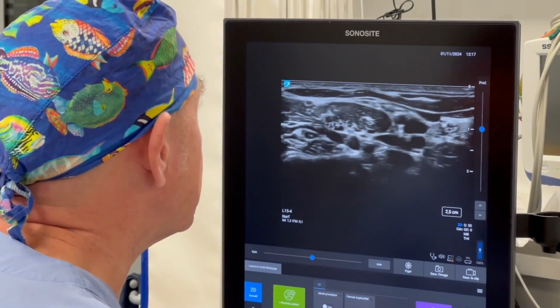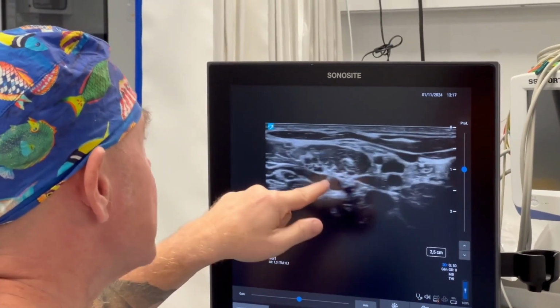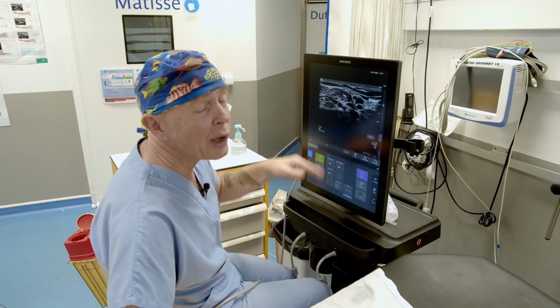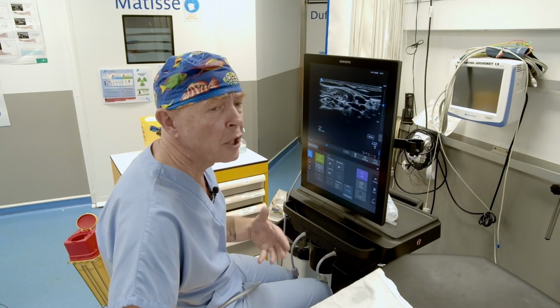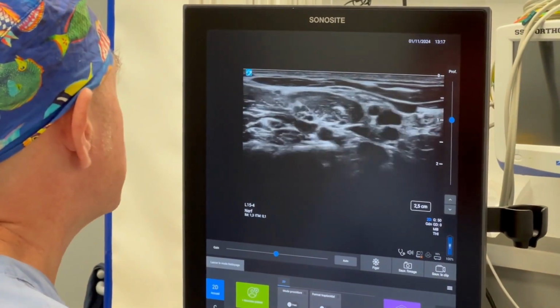So there are several reasons. First, we push the artery a little further away. Then we're sure to get both the anterior and posterior components of the inferior trunk. And that's often what's missing when you use the classic supraclavicular approach, and then you have the superior trunk.